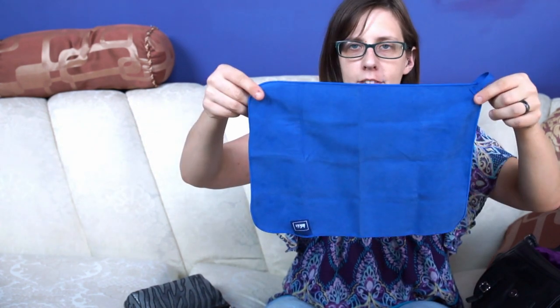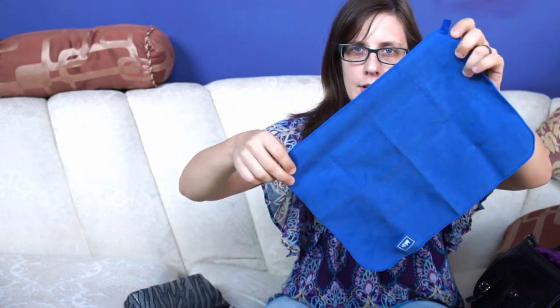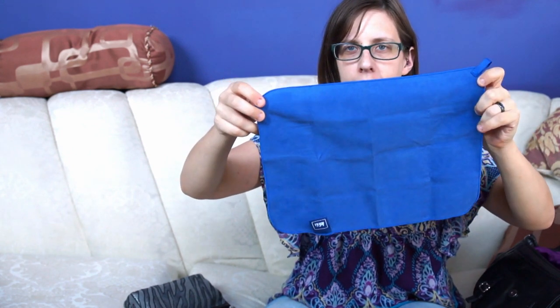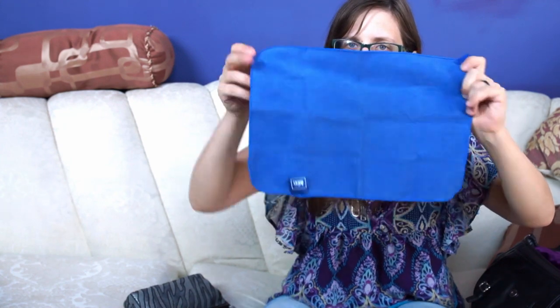The other thing I carry around with me everywhere I go is some type of microfiber cloth towel to dry off my leg should I need to take my prosthetic all the way off, or if my leg happens to get really super sweaty on the inside of the liner. This is a microfiber cloth towel — it's a camp towel, made by REI, and it's very useful for absorbing excess sweat or moisture. It's also really helpful for cleaning your glasses.